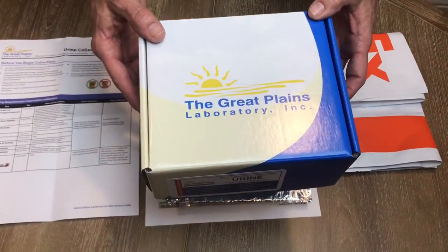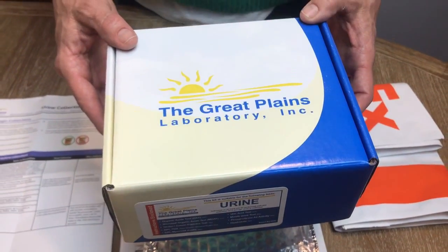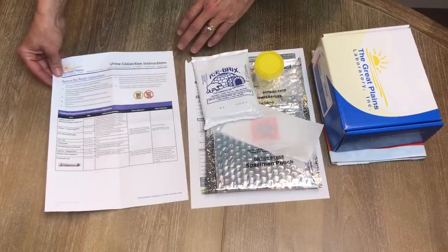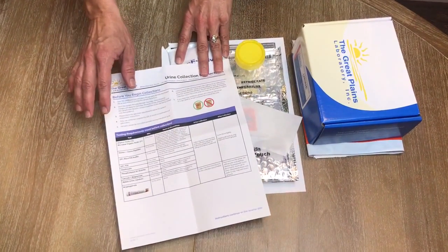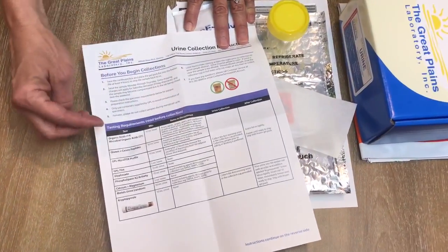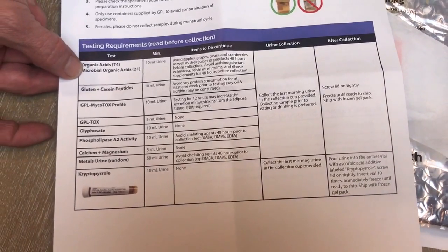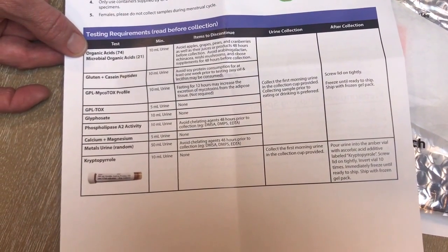This is a test kit instruction video for the Great Plains Laboratory urine test. First, we need to look over the requirements before you start. We're going to give you a test kit — we have several tests that we give out with Great Plains, so you're going to look on the side of the test kit that we give you, and we will highlight which test you're taking home.